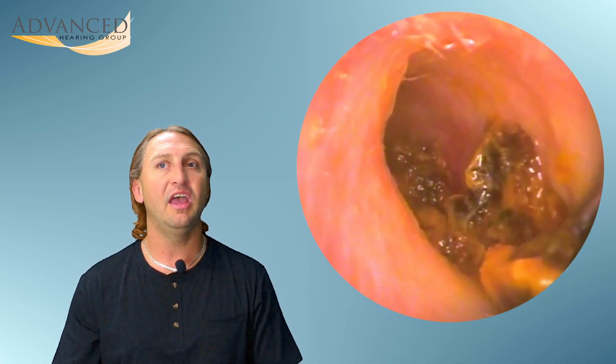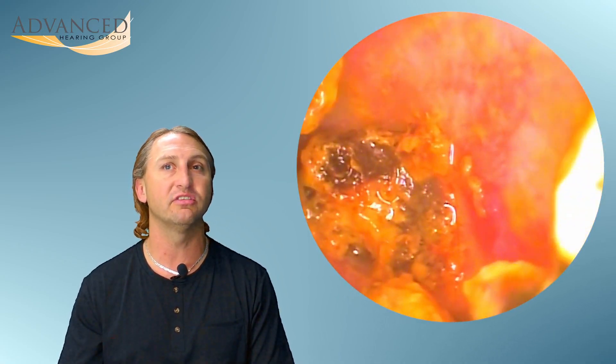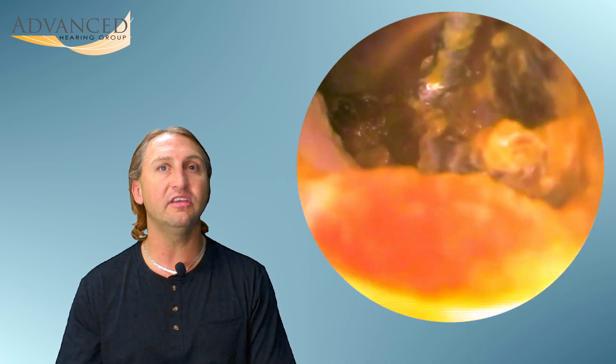Look at that, there's a big chunk coming out with this curette and you're also getting a whole lot of water. You can actually see the moisture in the earwax following the irrigation. We're going to get this out, see how red that ear canal is, and if anything needs to be done.